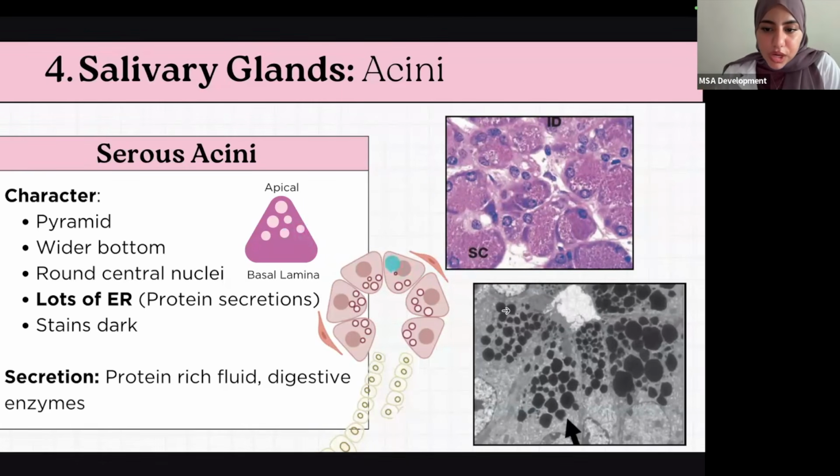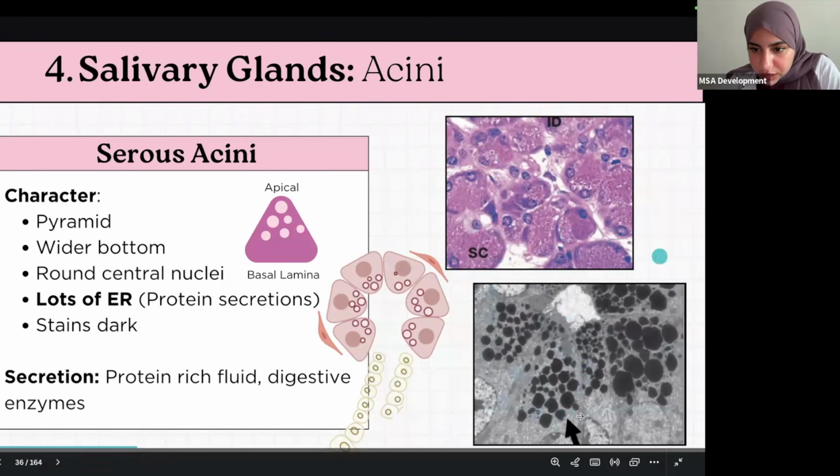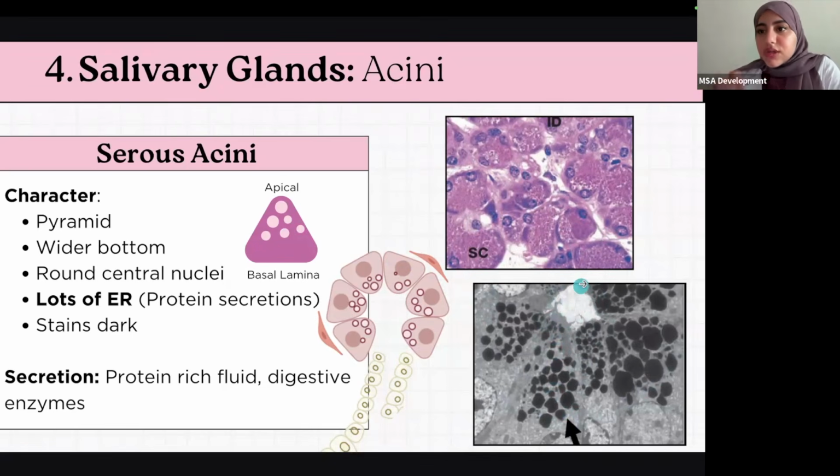And they have a wider bottom, and it's oriented like this. And so all of them would be like this. The granules would be at the top, and they would be secreted into the duct over here, and the duct would have a longer ductal system.